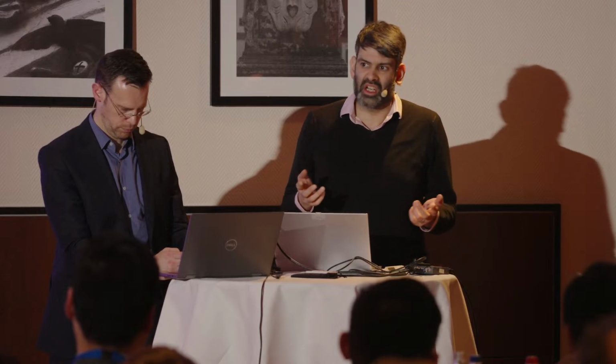And I would say you can start using it anywhere. I wouldn't say one territory or more. I think if you've used it mostly in arterial disease before, probably FemPop is where it's a safe space to learn, because it's much easier to interpret. The crossing is usually easier.